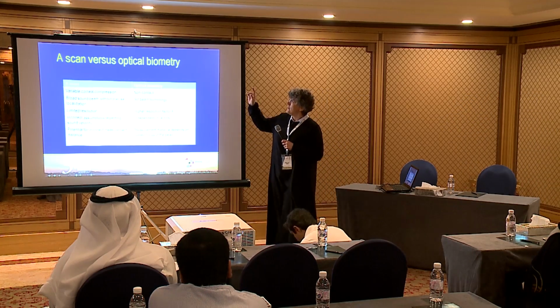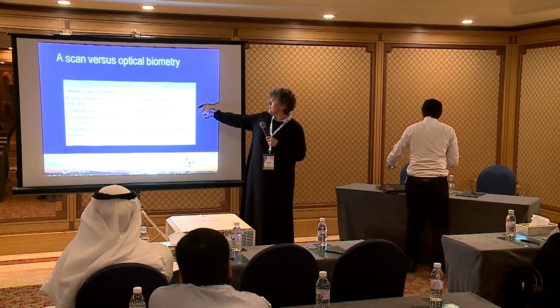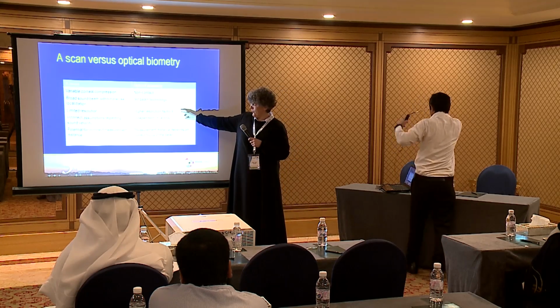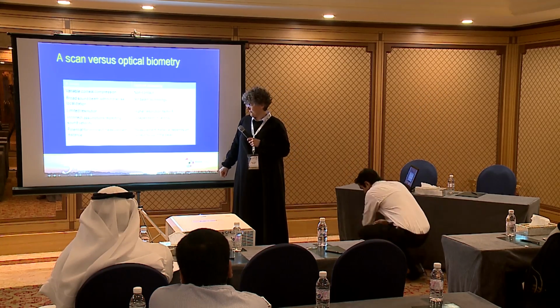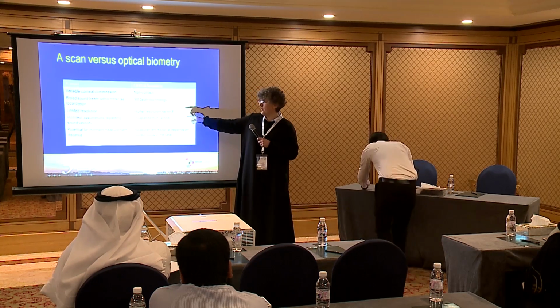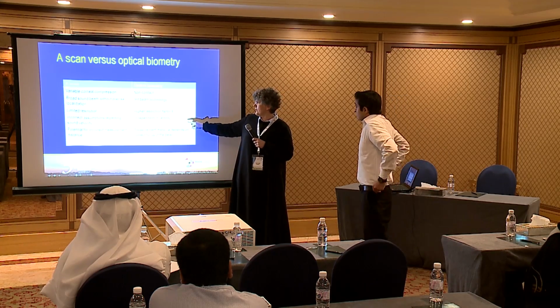So again, A-scan versus biometry, non-contact, a slit beam. The A-scan has a limited resolution. The higher resolution comes with the optical biometry. We're making incorrect assumptions about the ultrasound beam. And in the optical biometry, it's independent of this.